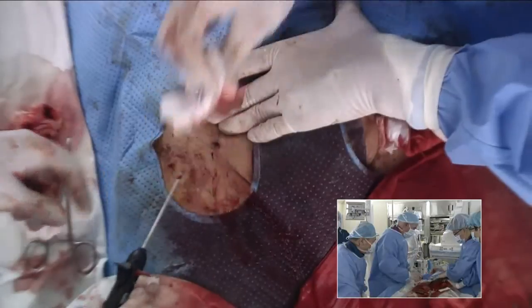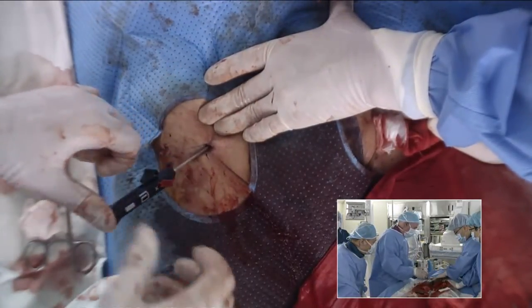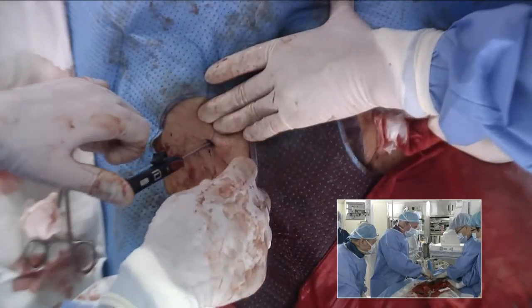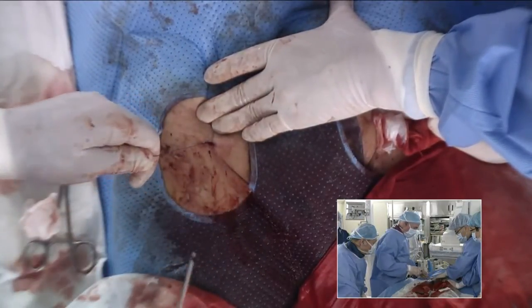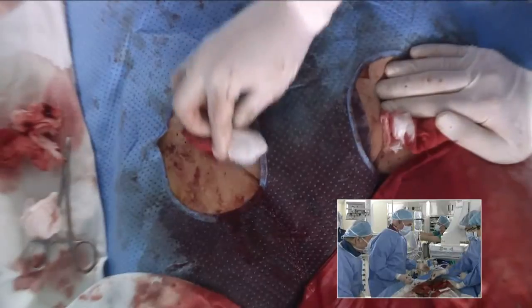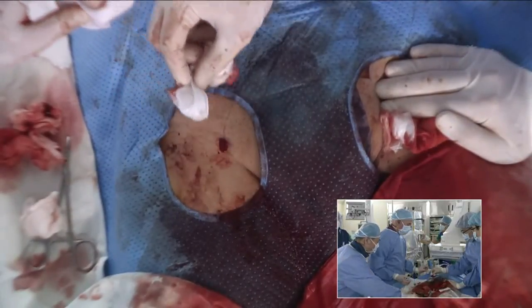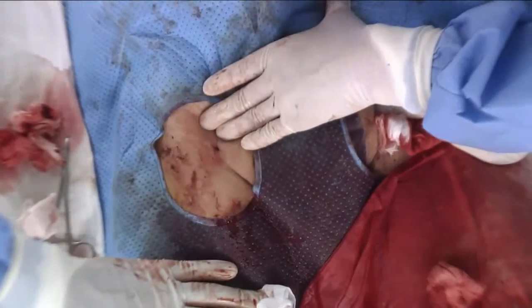And then I'm going to go ahead and go down again with a knot pusher on this side, number two, and lock this knot. And so we're almost totally hemostatic there. That'll just be a few minutes of holding. So I think we'll be good here, Rich.